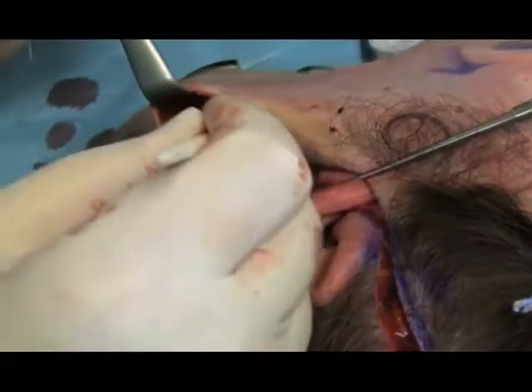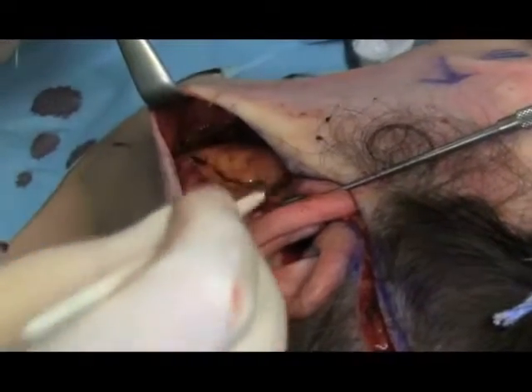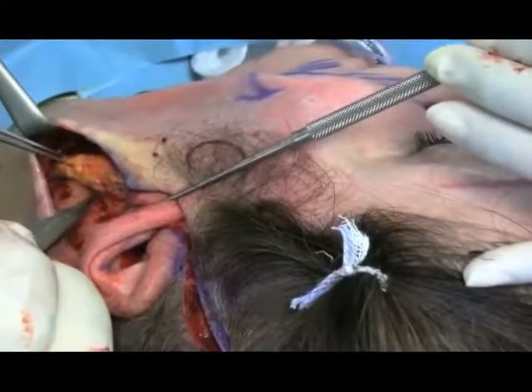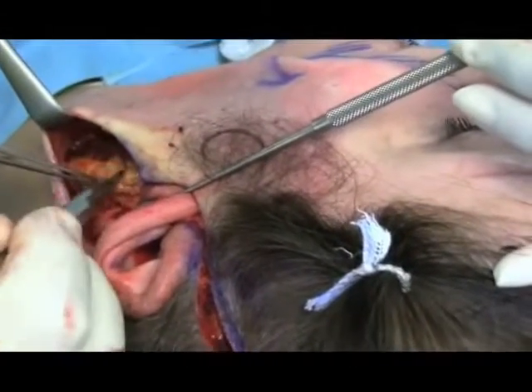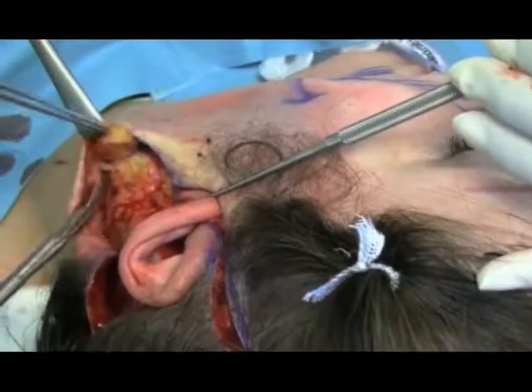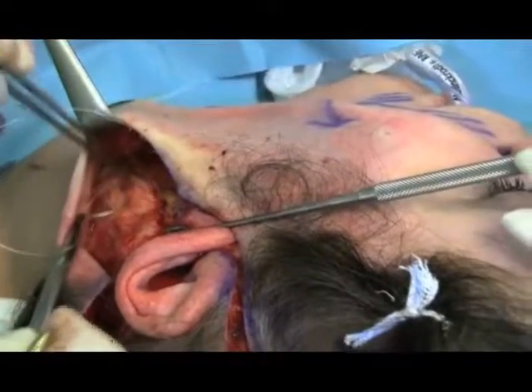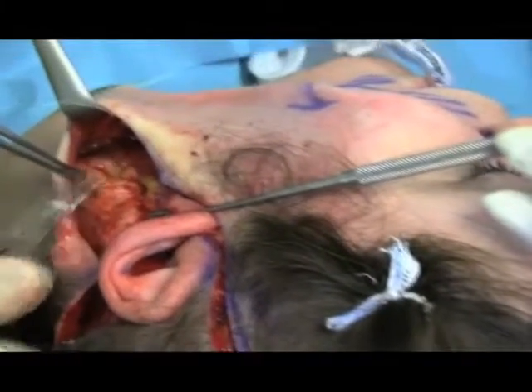The dog ear thus produced is marked and excess SMAS excised. It may be used if required for a segmental fat graft elsewhere. The cut edges are approximated with 2-0 PDS.